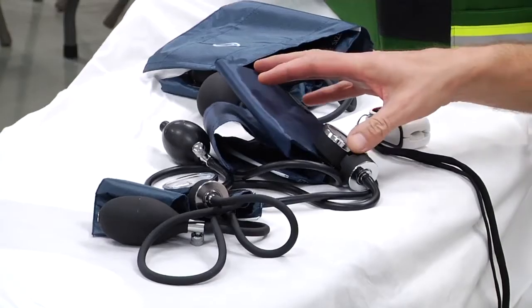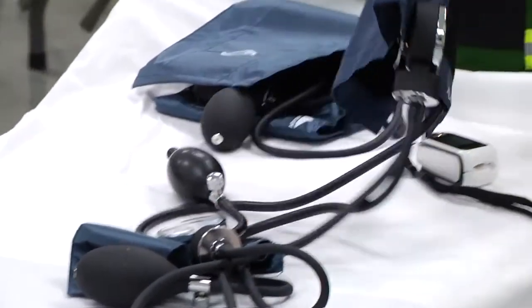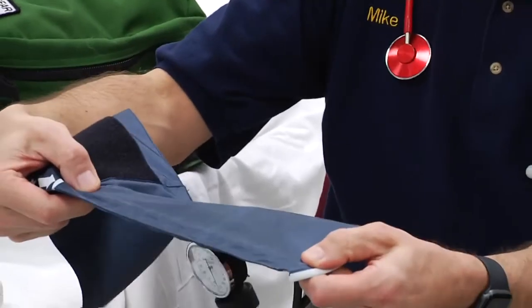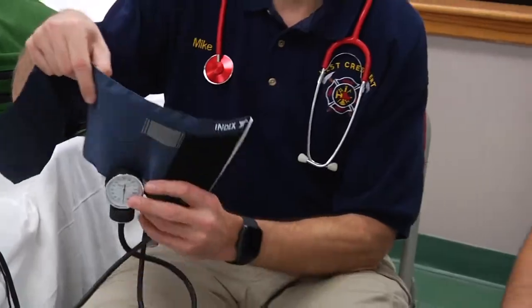The first thing about measuring blood pressure is the size of the blood pressure cuff that you're using. If you look at the American Heart Association guidelines for blood pressure measurement, they mention that you should actually measure the circumference of the patient's arm and use a cuff that has a bladder — the piece that actually inflates on the inside of the cuff — equal to two-thirds of the circumference of the patient's arm.